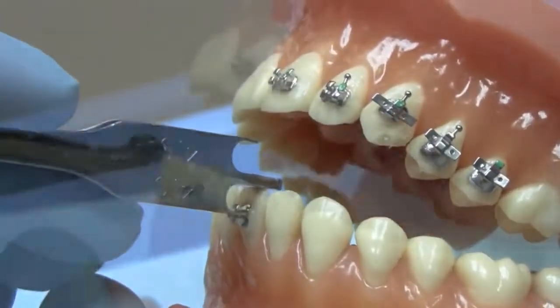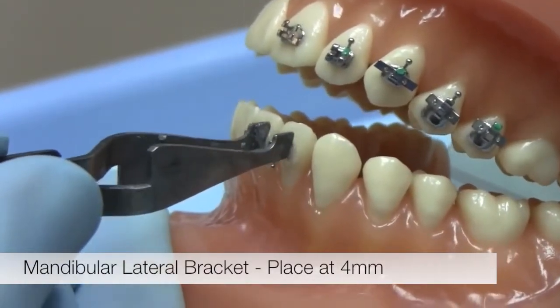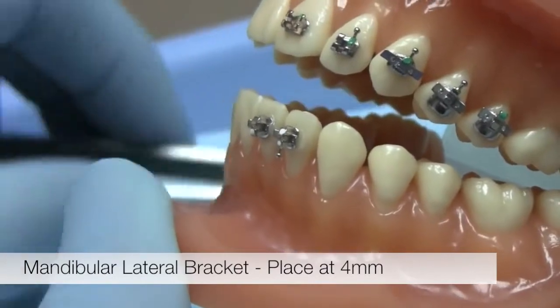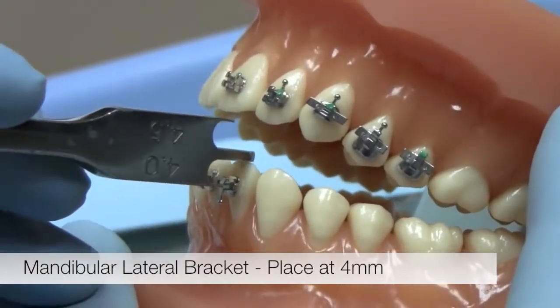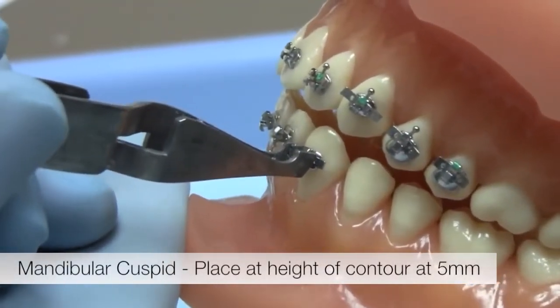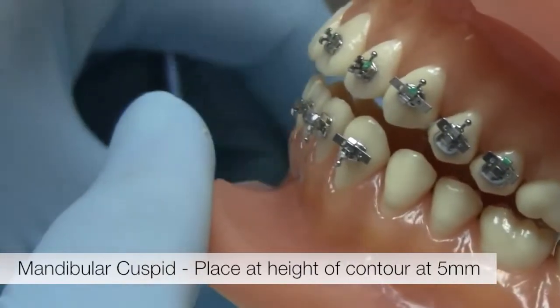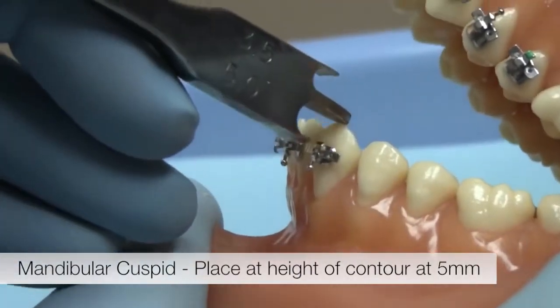The next bracket to place is the lateral bracket, which has a ball hook. It is placed just like the central with a height of 4 millimeters. These are the four most important brackets in the whole case. Next, place the mandibular cuspid, which is a round surface tooth, so you will want to place it at the height of contour and not at the center. This bracket should be at a height of 5 millimeters.